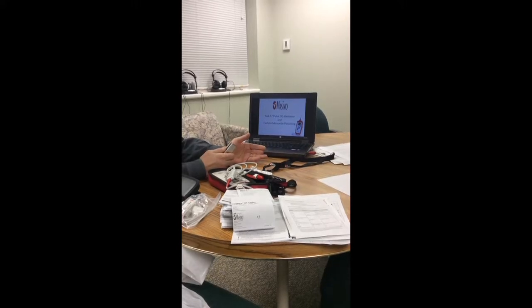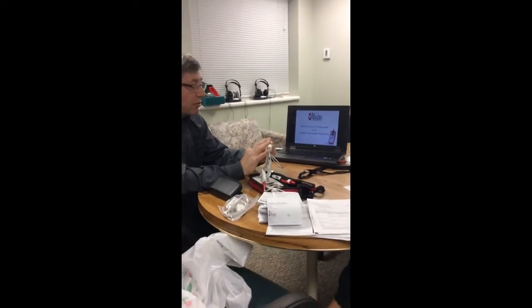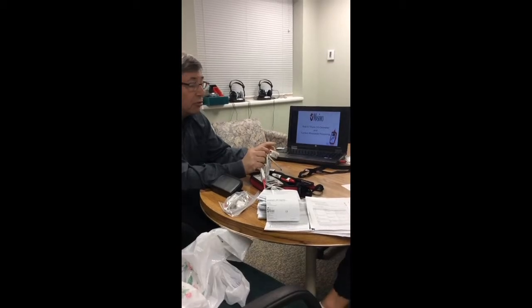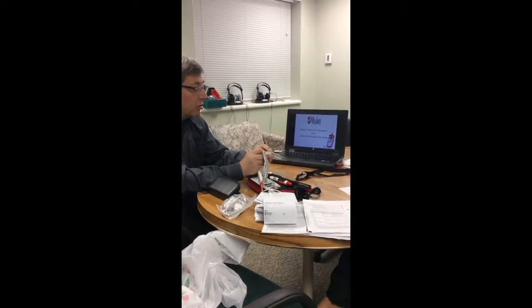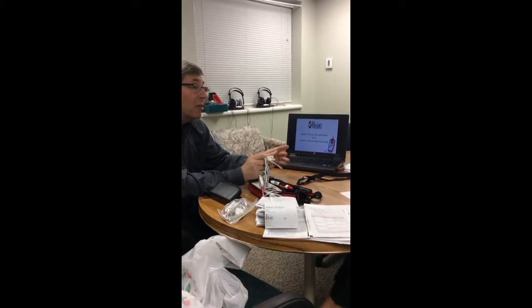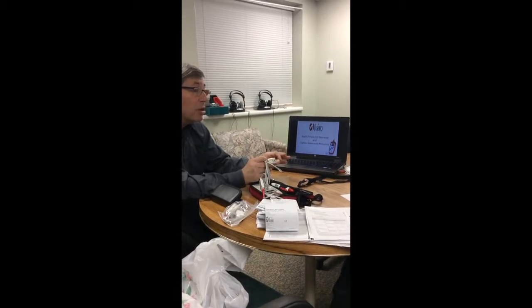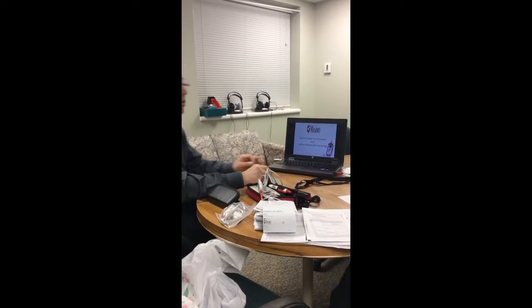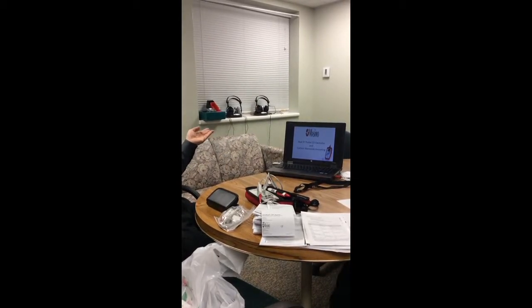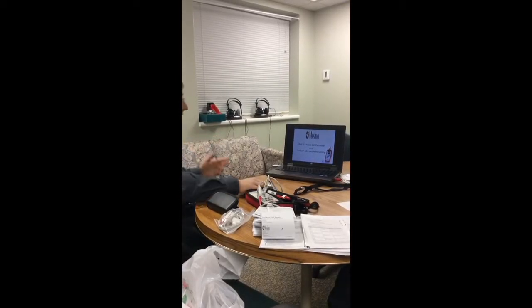Oximeter does. You have an emitter and a detector, and you've got a red over infrared light that's shining through the nail bed, and based on the reflection and absorption, it's going to give you a reading of SpO2, and it's also going to give you a pulse rate. But the SpO2 is going to be looking at total hemoglobin. It doesn't know if there's a dishemoglobin that's attached to that hemoglobin molecule, so the patient will present bright red. It'll have normal sats. However, what's being transferred to the tissue is less than optimal.